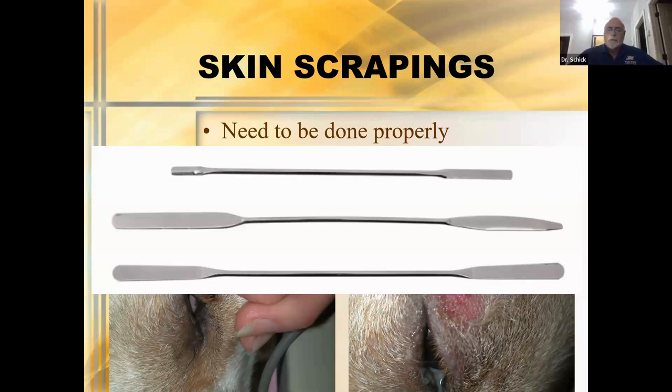These are the skin spatulas I still use in my practice. You can certainly use a blade — just make sure you dull it. My senior year, one of my classmates took a rambunctious Dalmatian puppy and decided she would scrape this dog by herself. She hadn't dulled her blade, and we ended up involved in emergency eyelid repair surgery. So be careful. These spatulas — the one in the center is what I use — do a great job, and you can never cut an animal as long as you use a spatula.